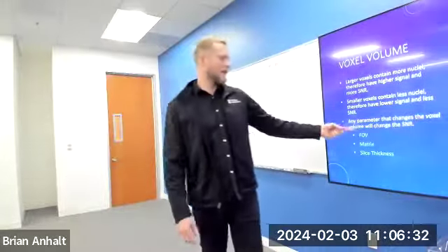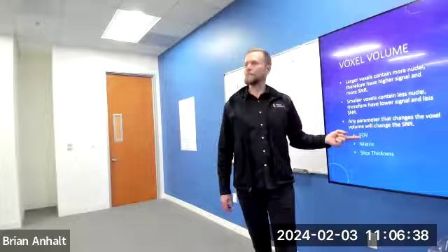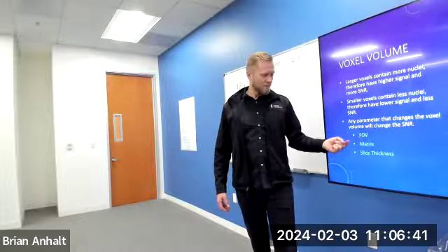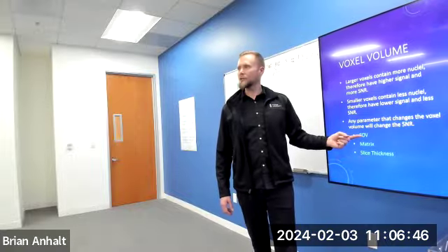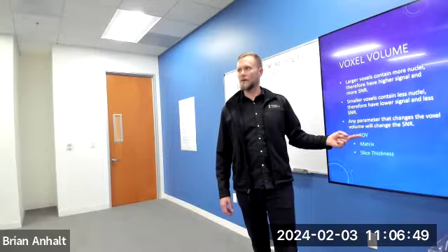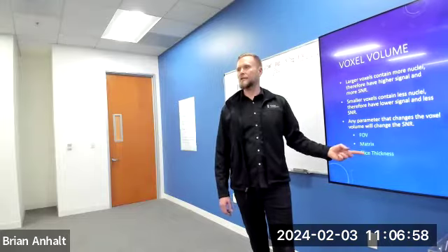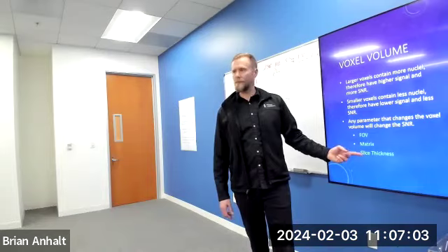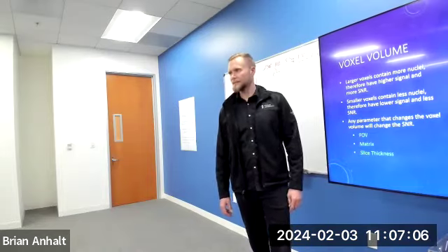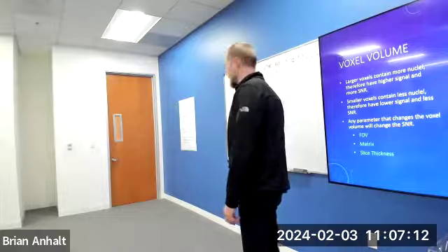Any parameter that changes voxel volume will change SNR then. What affects our voxel volume? Field of view, matrix, and slice thickness. So anything I change in the field of view to give me a smaller voxel will give me less SNR. Anything I change in the matrix to give me a smaller voxel will give me less SNR. Anything I change in my slice thickness to give me a smaller voxel will give me less SNR. And this becomes confusing. It's pretty simple with field of view and slice thickness, but the matrix confuses everybody. But it won't after this.